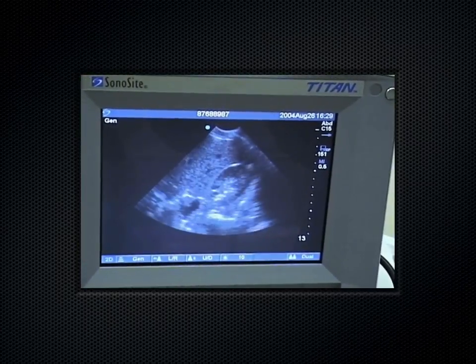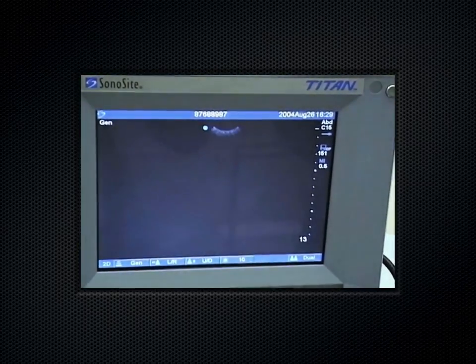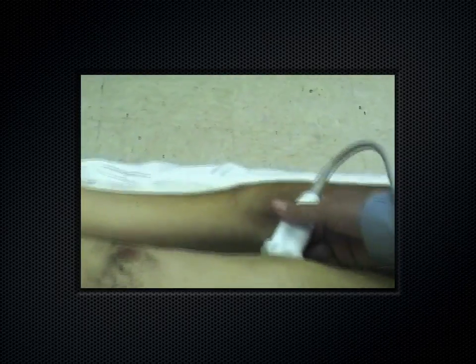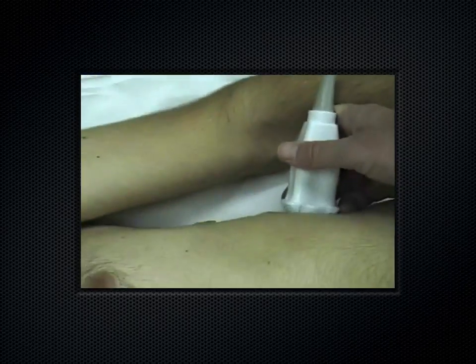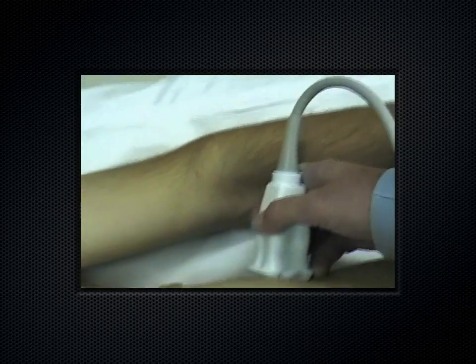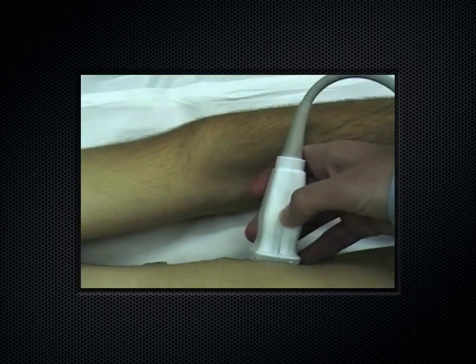If you rotate the probe 90 degrees you get a short axis. On the left side it's the same approach: indicator towards the patient's head for the long axis, then rotate toward the ceiling for the short axis.